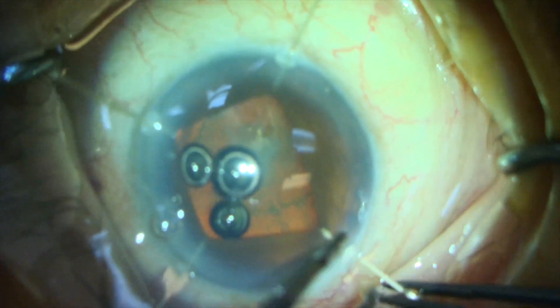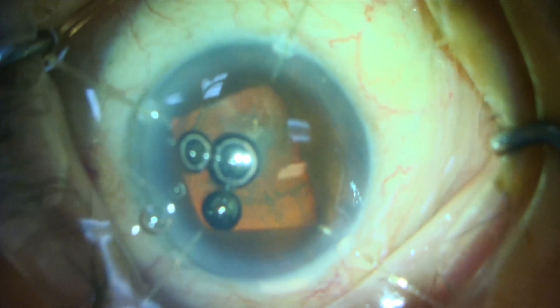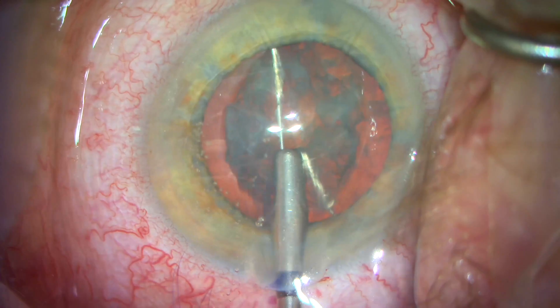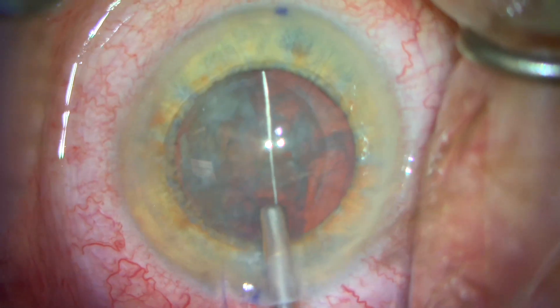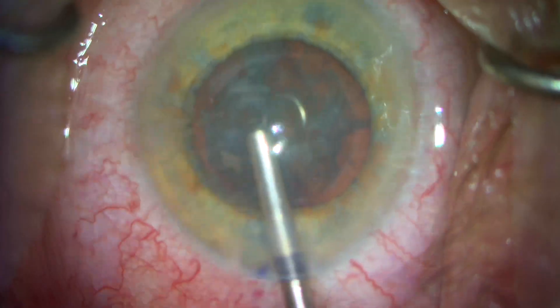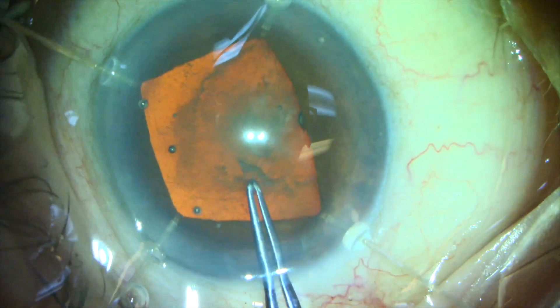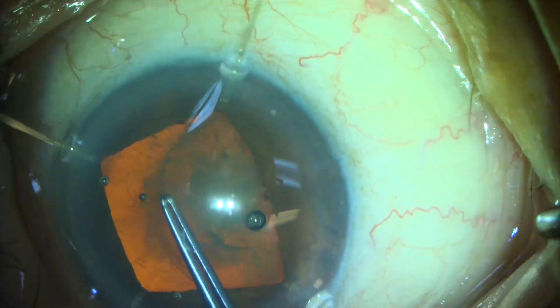These types of cataracts have a higher complication rate due to the fact that the cataract is more challenging to remove. The MyLoop made by Carl Zeiss is a device we've used for these types of cataracts, but in my opinion, the MyLoop places a significant amount of stress on the zonules. In this 89-year-old patient, I'm concerned about zonular dialysis that may be created by using the MyLoop. Of course, we could try to chop this cataract, but these dense cataracts often do not chop as easily, as there's usually a dense, leathery posterior plate to the cataract that is resistant to cracking.